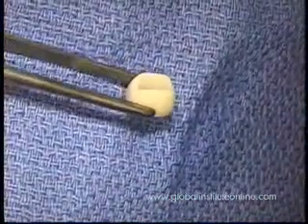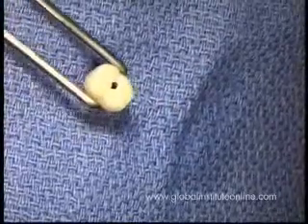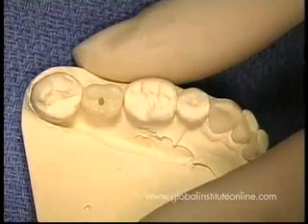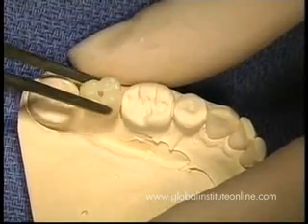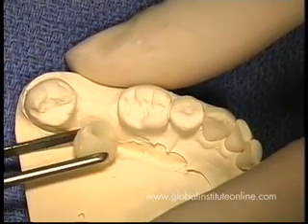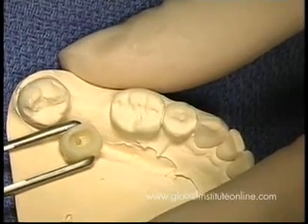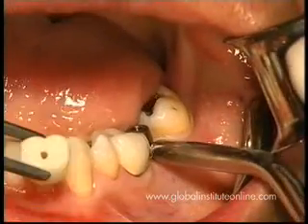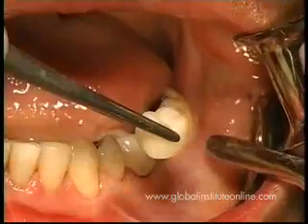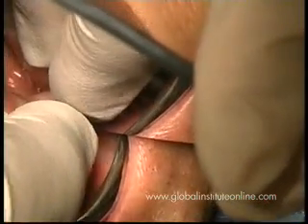In the pre-planning of this particular patient, a diagnostic wax-up was done, and an acrylic shell was fabricated on the study model. An occlusal vent hole was prepared to allow for the retrofitting of the acrylic to have access through this occlusal hole. This then is being used with additional acrylic, where we're seating it directly in the mouth on the patient's implant, as you can see here.